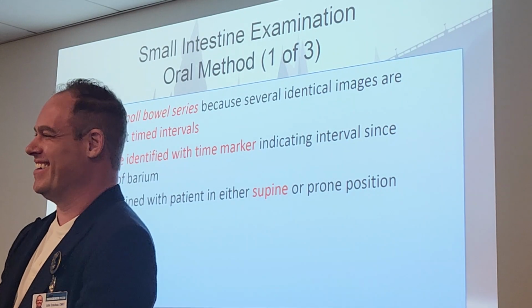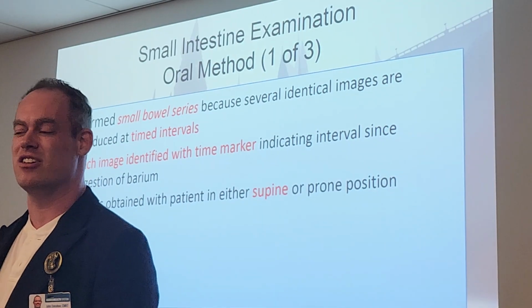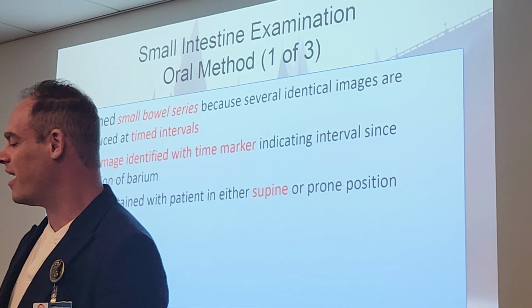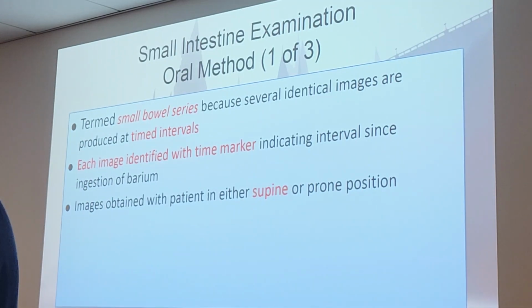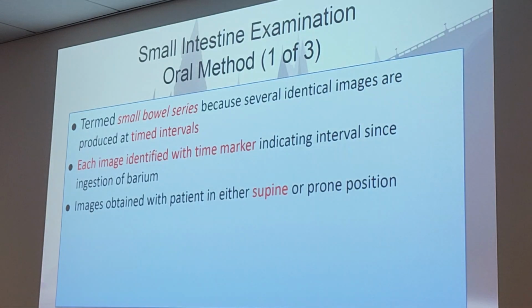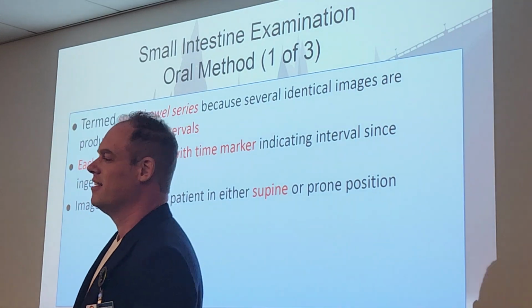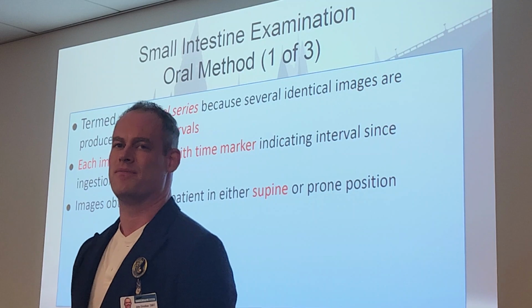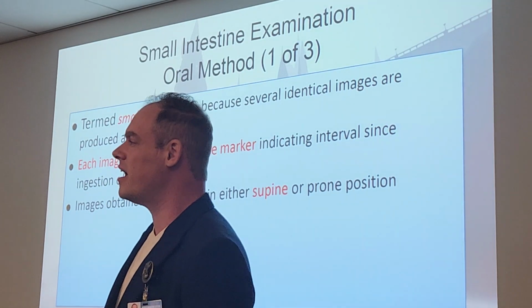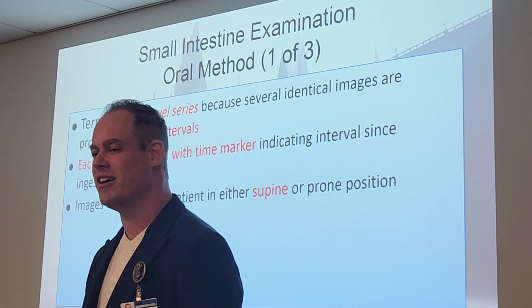Okay, so for the small bowel, we call it a small bowel series because it's a series of KUBs alongside the doctor doing fluoro at the end. These are going to be produced at timed intervals, usually starting at 15 minutes, 30 minutes, 45 minutes, an hour, 2 hours, and so on. Not weeks or months, hopefully no more than 2 days is usually the max. Each image, very important, we must identify with a time marker. Do we use digitized time markers?